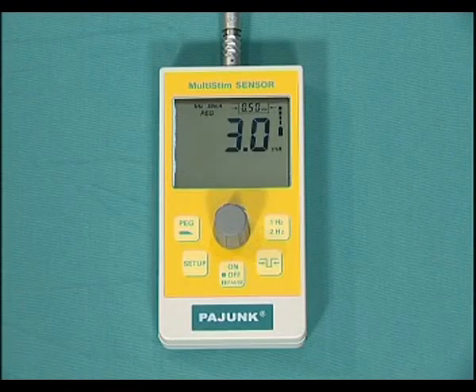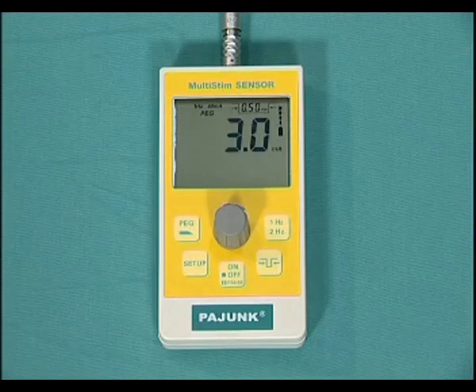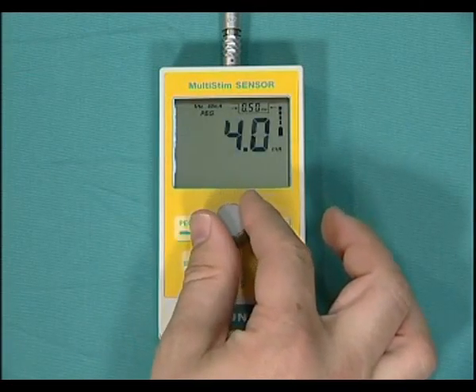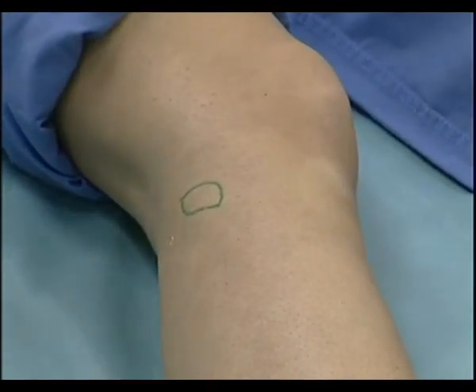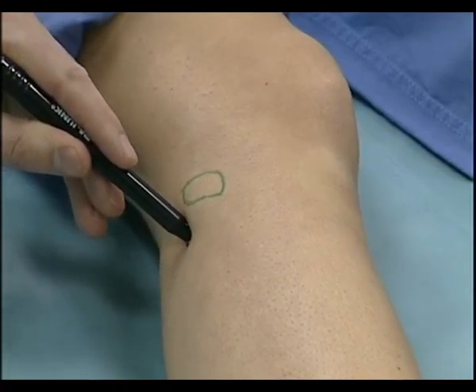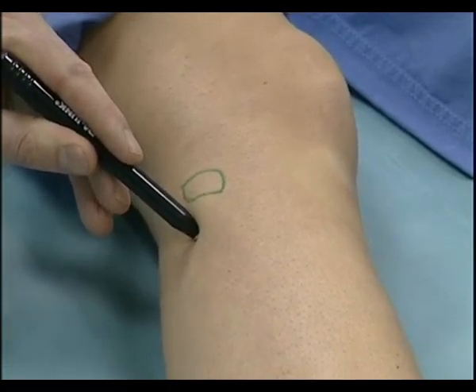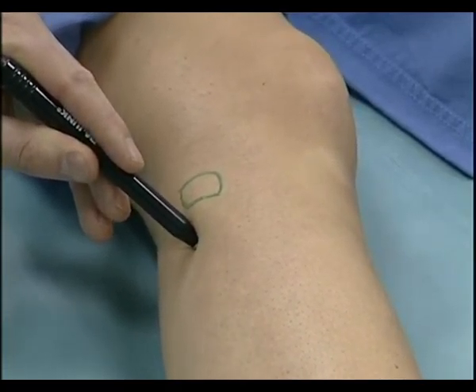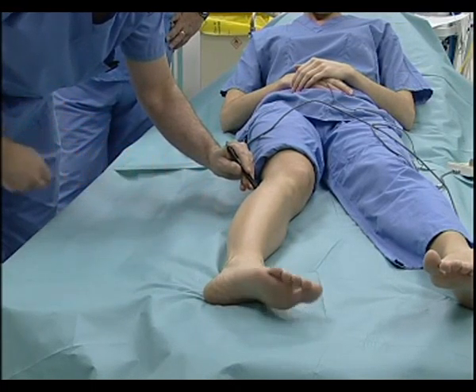We suggest commencing at a current of 3 milliamps for upper limb blocks. For lower limb blocks, the current is commenced at 5 milliamps. To locate most of the peripheral nerves, only light pressure need be applied to the skin surface, to which has been applied a water-based lubricant. The PEG is moved over the skin surface until paresthesia or a motor response is elicited.